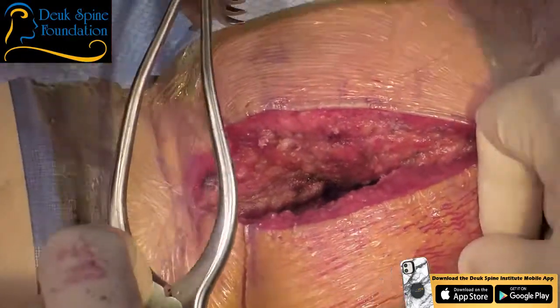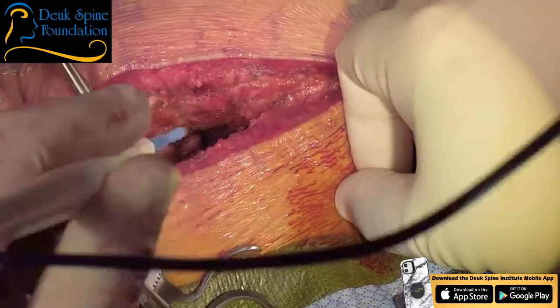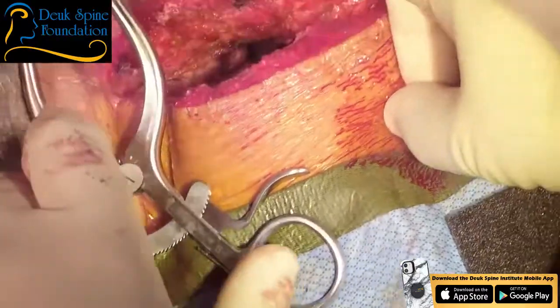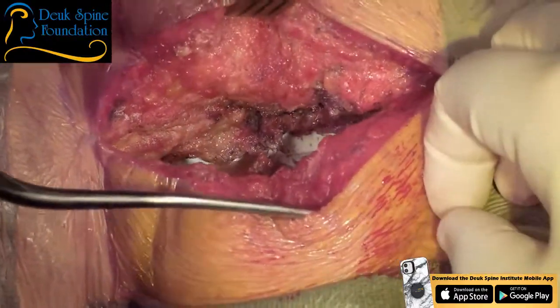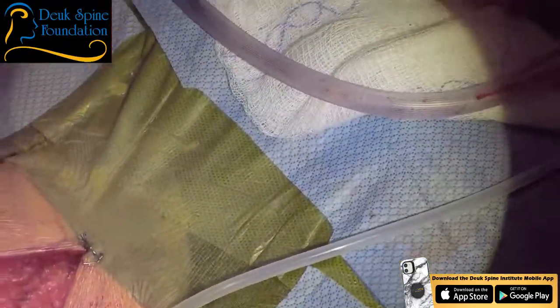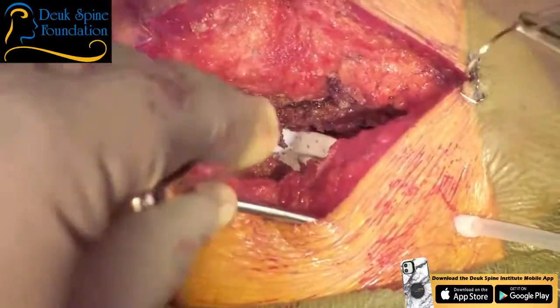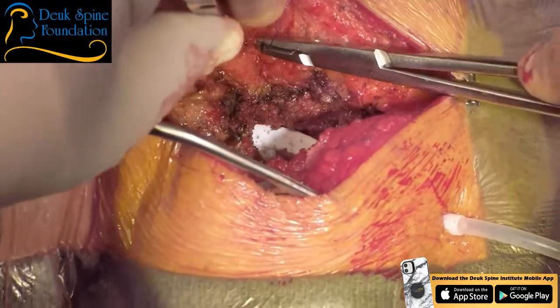Ooh, he looks like he wants to bleed. Let me have a Bovie. Yes, sir. All right. So first layer we're going to close is the fascia. You don't want to close muscle, suture. Fascia is deep here in her. So I can see it right here. It's very thick.